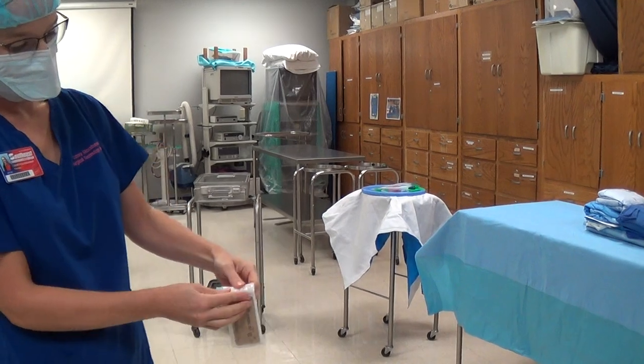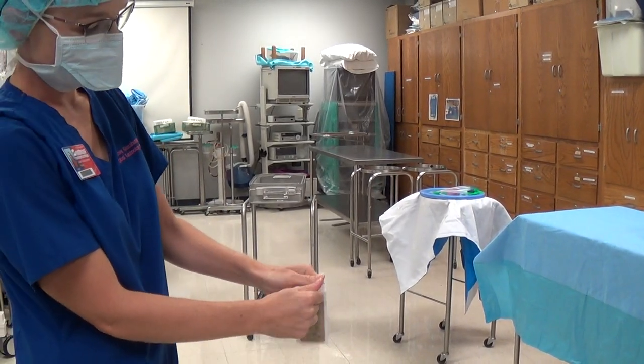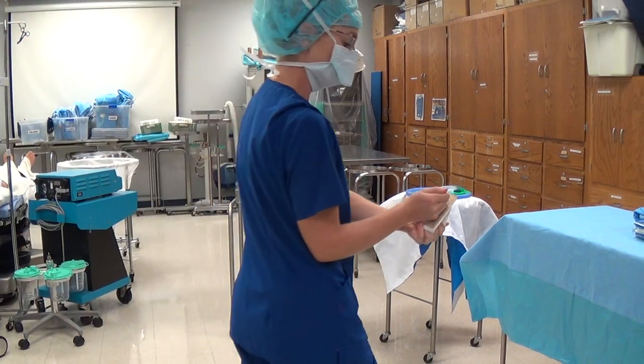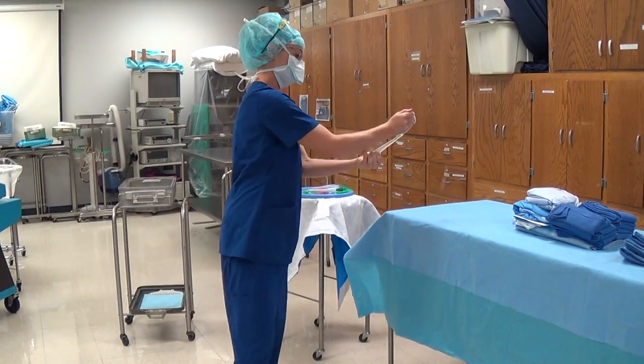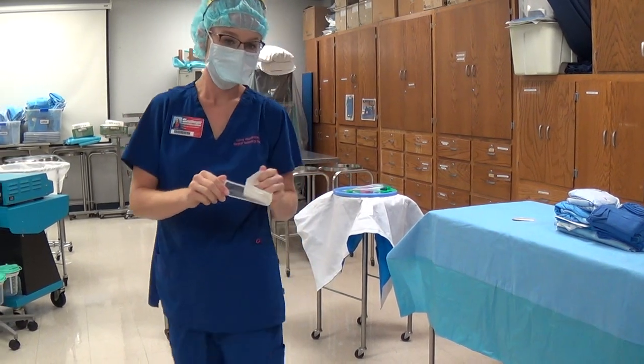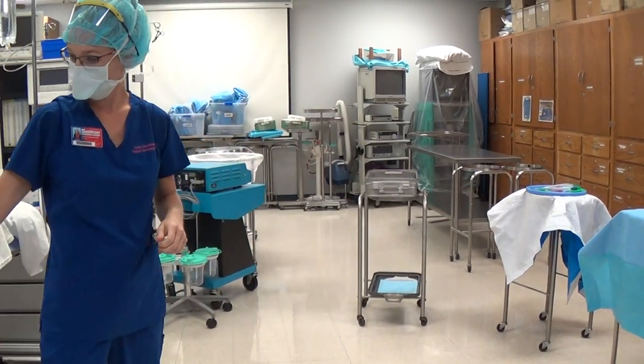Casey's grabbed suture next. She's going to pop the suture, see which side it rests on, and crack and shoot it onto the sterile field without going over. She's staying that 12 to 18 inches away, not putting her back to any of the sterile items that are open, and checking for holes.